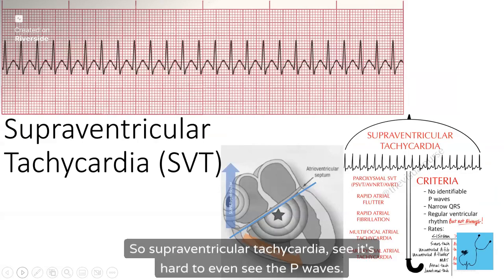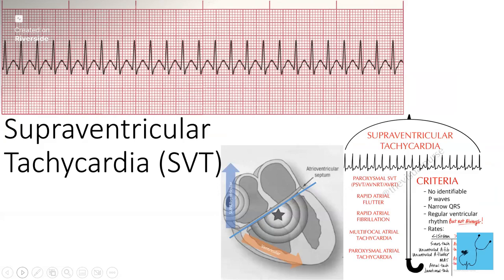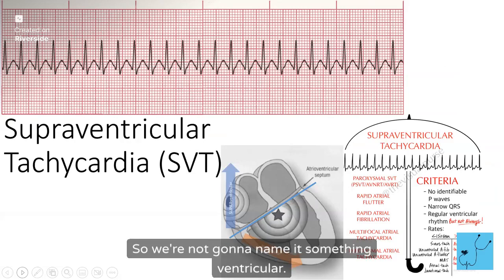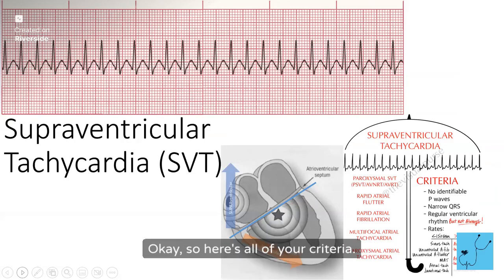So supraventricular tachycardia, see, it's hard to even see the P waves. But we know it's not ventricular because the QRS is narrow. So we know it's something above the ventricle, so we're not going to name it something ventricular.